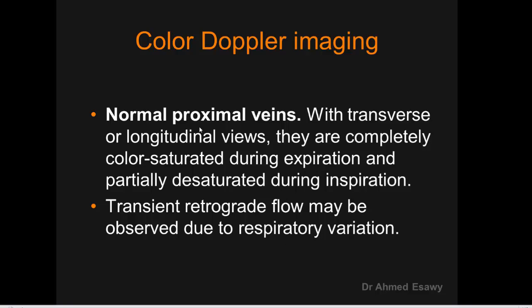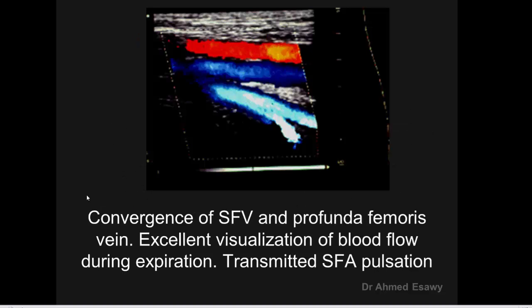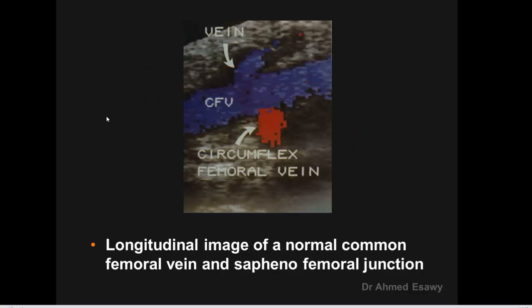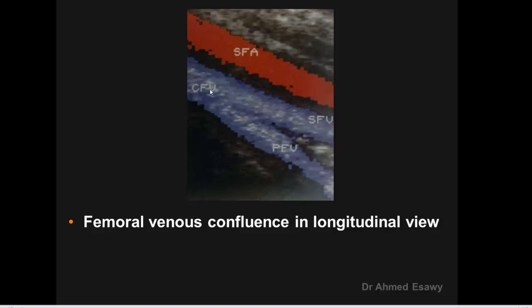Color Doppler imaging: normal proximal veins in transverse and longitudinal views are completely color-saturated during expiration — common femoral vein, superficial femoral vein, popliteal vein — and partially desaturated during inspiration. Convergence of superficial femoral and profunda femoral with excellent visualization during expiration. Normal common femoral vein is shown receiving blood from the great saphenous vein and formed by superficial and profunda femoral veins — completely color-saturated, normal appearance.